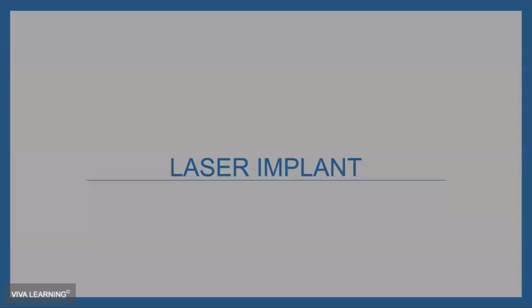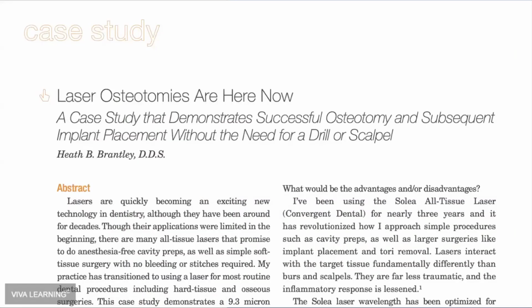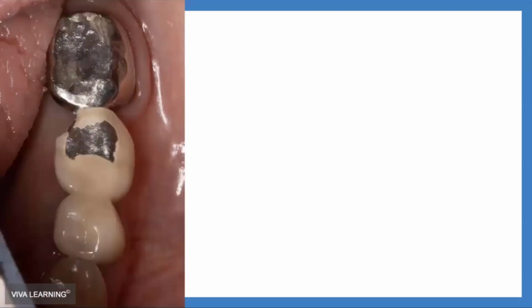And that brings me to my last case tonight. Right at the beginning of COVID, of course, April 2020, I had submitted an article that got published in CDocs, and it was talking about doing laser osteotomies. So, I took the laser pilot drill to a whole other level. I thought, like, let's do the whole osteotomy. Don't use any rotary instrumentation. I didn't even use a scalpel blade to make the flap. And so it got published in April 2020, which is a terrible time to publish anything. But, of course, I didn't know what was going to happen there.